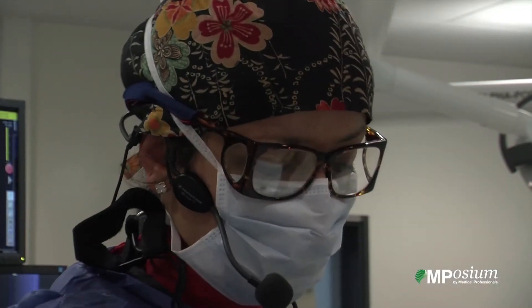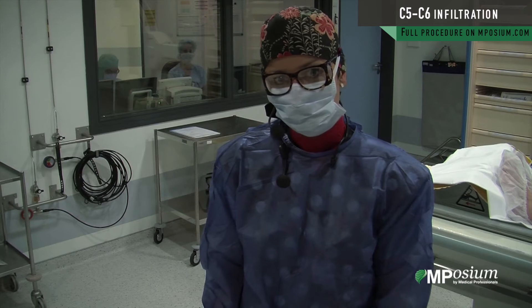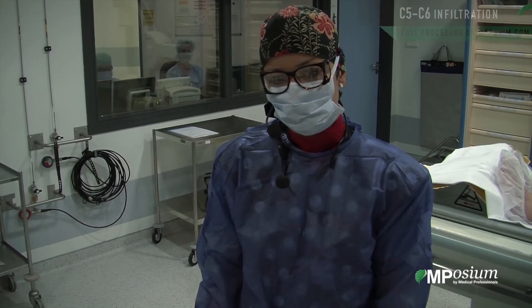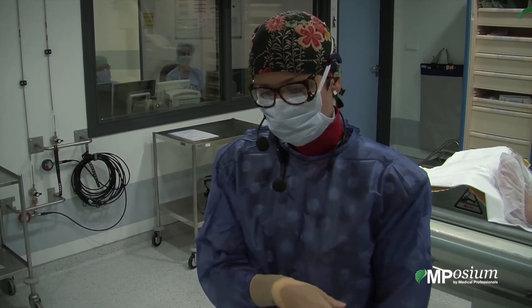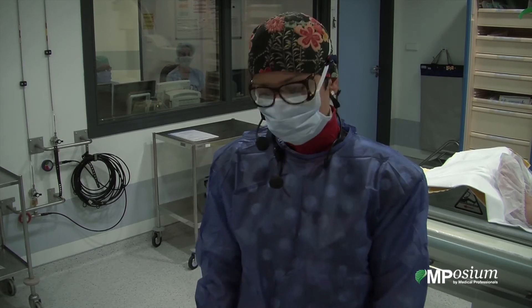This is a cervical foramen infiltration for C6 pain. The patient has a cervicobrachial pain on the left side.